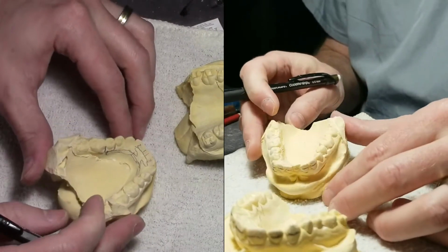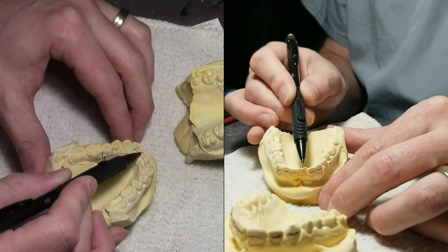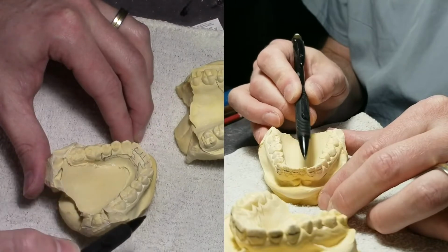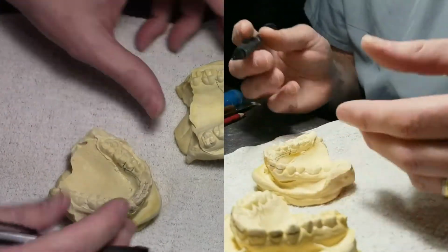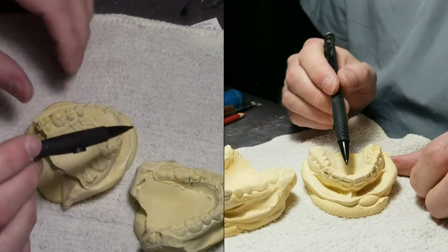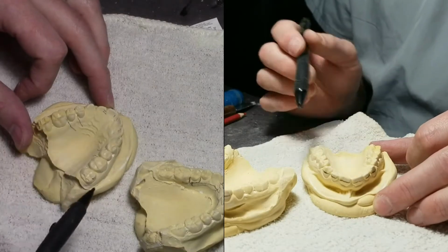That is number one that you need to do, is mark the teeth. I like to use red on the right and then regular pencil color on the left. I mark them 1, 2, and I put it on the mesial side of the tooth, so that after you cut these out, especially the lower anterior, they look a lot alike, and you'll see that whenever I cut them out. Of course, the upper I do the same thing, red on the right. I know it's not the patient's right, but my right. Red on the right, and regular on the left.